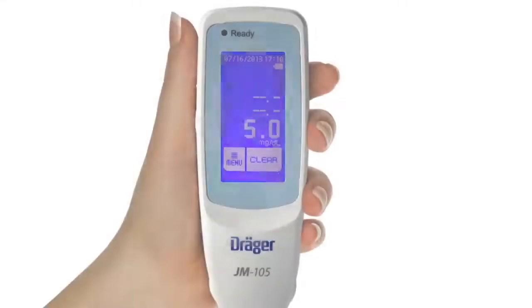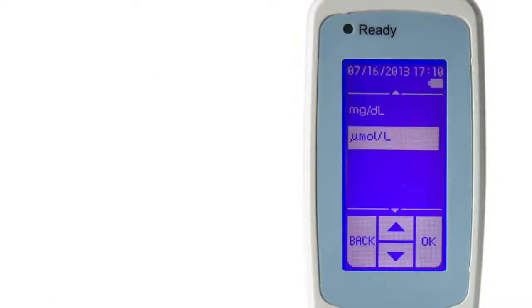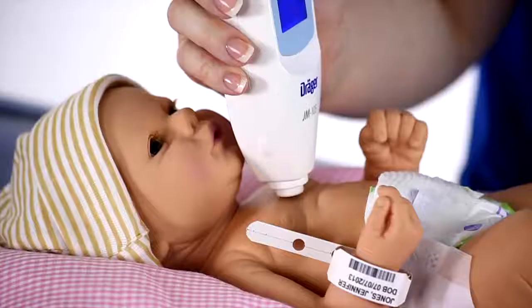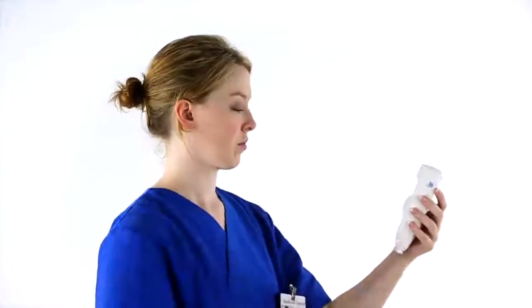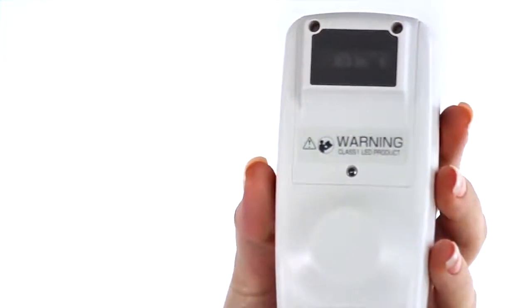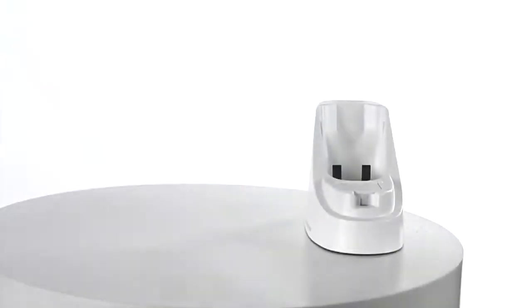An easy-to-read display shows the measured transcutaneous bilirubin value. Values can be displayed either in milligrams per deciliter or micromoles per liter. We will demonstrate how to change the units later in the program. The measuring probe takes a measurement when pressed against the infant's skin. An optional built-in barcode reader is located on the back of the device. The barcode reader will emit a red light when you scan a nurse or baby ID. We will demonstrate how to use this later in the video.